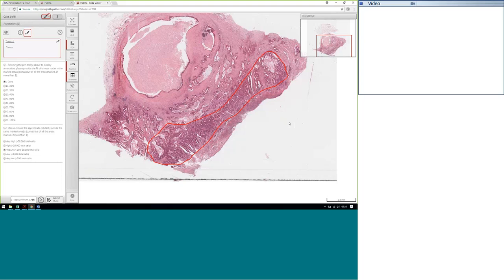We invite the participants to comment on the percentage of tumor and the cellularity. The area, as you can see, has been marked. From a clinical history point of view, it was a 75-year-old male with a PT3N2 tumor on resection, and the submitted sample was for molecular analysis. We can see that the area for microdissection has been identified along this portion.